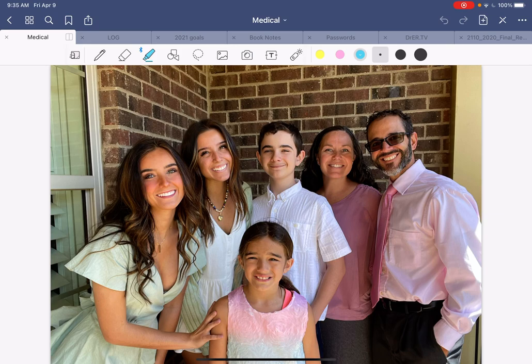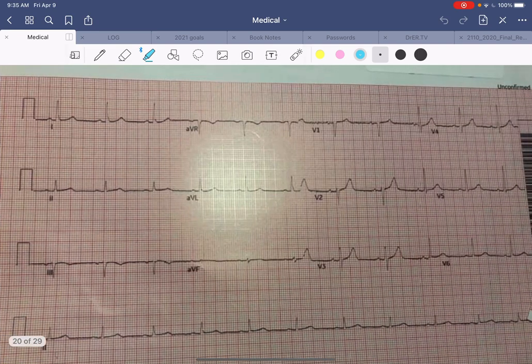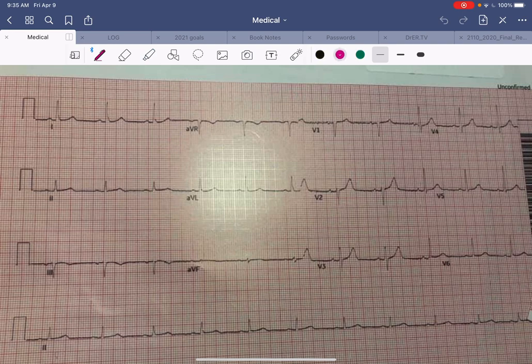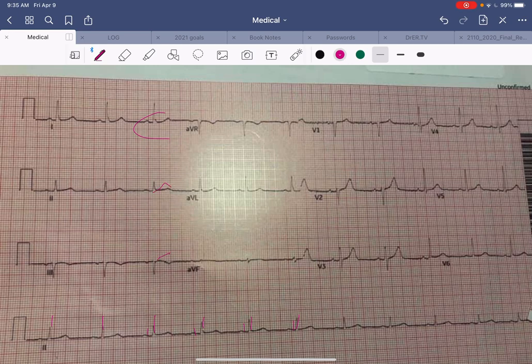Today's Friday and it's EKG day, so we're going to do an easy one. This patient presented with chest pain to the emergency department. The first EKG looks pretty sinus — it's regular, each QRS is at equal length, each QRS has a P wave, so it's sinus rhythm.